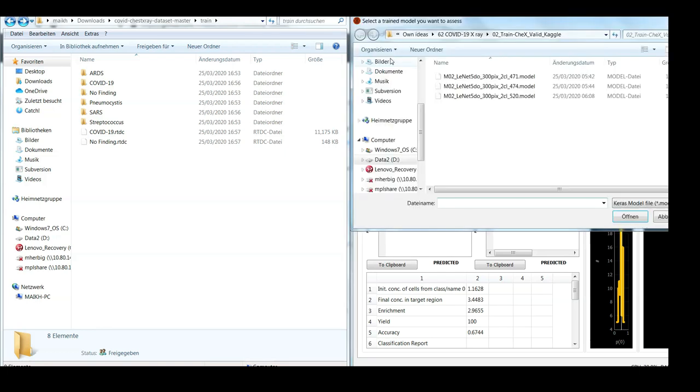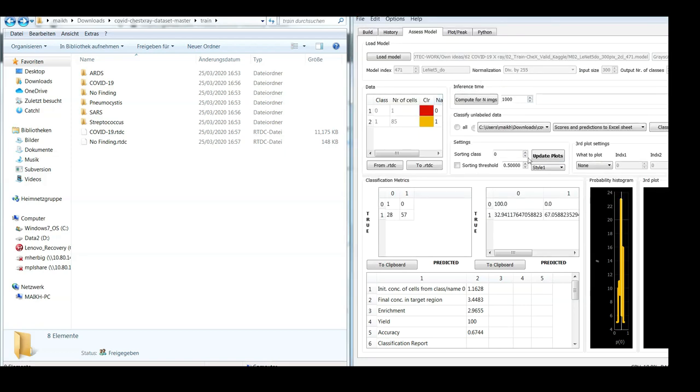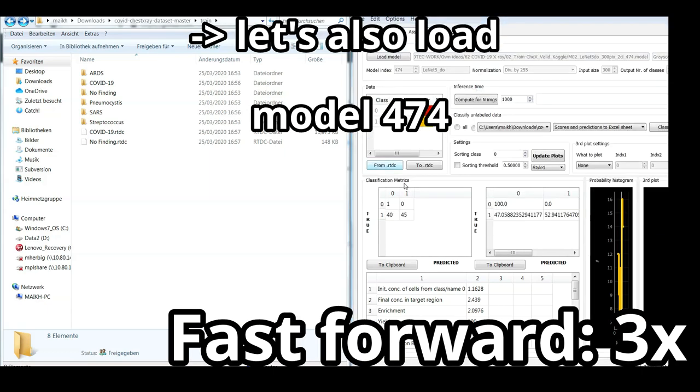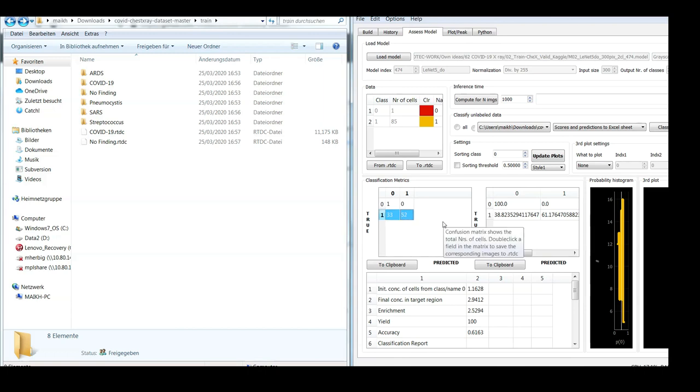To verify that this is actually coincidence, I could also just load another model, let's say this one. Update plots. And here we can see that it's almost 50-50. Also, this model actually prefers to classify COVID-19 patients into the class of pneumonia patients.